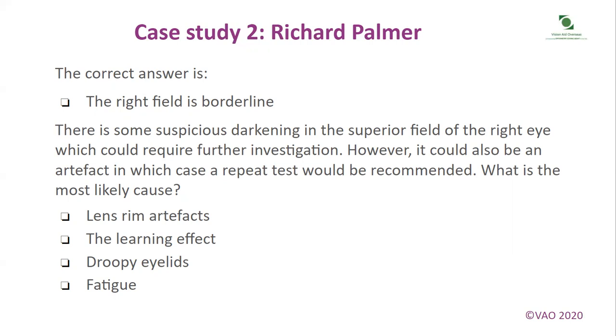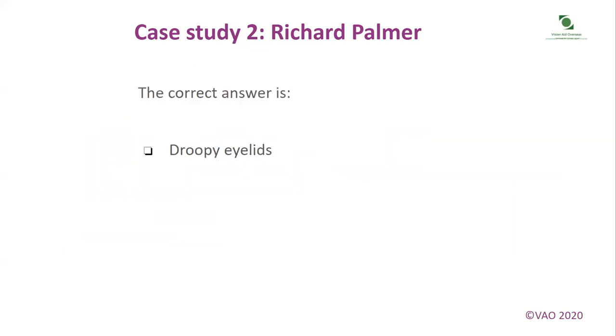What is the most likely cause of the artifact? Lens rim artifact, the learning effect, droopy eyelids, or fatigue? The correct answer is droopy eyelids.